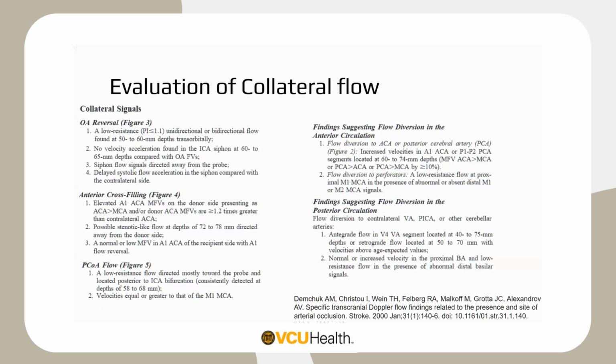And this is thought to represent perhaps activation of leptomeningeal collaterals. So if your MCA is occluded, you may see increased flow velocity through the ACA as the ACA takes on extra blood flow for leptomeningeal collateralization to the MCA, occluded MCA territory.